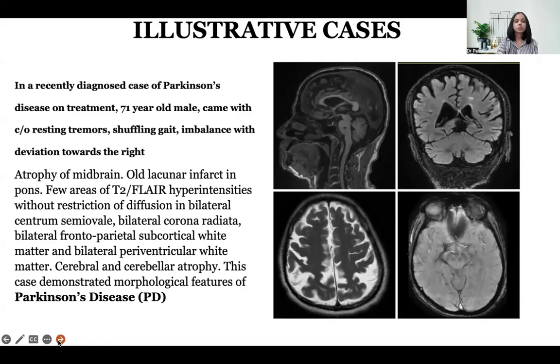Illustrative case 1: a recently diagnosed 71-year-old male with Parkinson's disease on treatment, presenting with resting tremor, shuffling gait, balance imbalance and deviation towards the right. MRI was suggestive of atrophy of the midbrain, old lacunar infarct in the pons, few T2 FLAIR hyperintensities without restriction of diffusion in bilateral CSO and CR, bilateral frontal and parietal regions suggestive of chronic ischemic changes, and cerebral and cerebellar atrophy. This case demonstrated morphological features of Parkinson's disease.